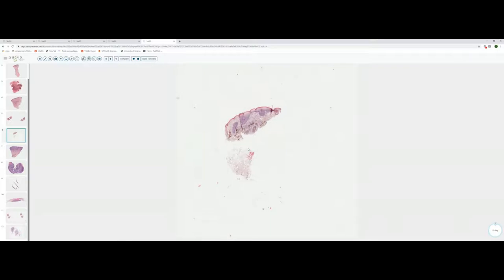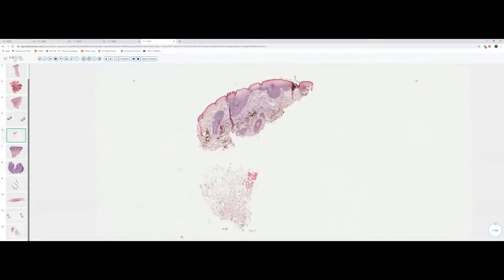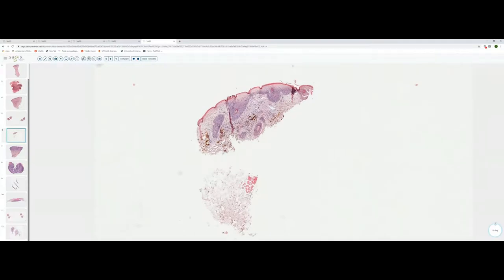Slide six is a much smaller biopsy specimen. This is a punch biopsy, and you know there's a fairly high concentration of follicular units here, they're kind of small and vellus. Another clue to location on the face here is the presence of skeletal muscle. And remember the muscles of mimetic expression on the face insert into the dermis. So it's one of the few areas, face and neck, the platysma, where you're actually going to see skeletal muscle extending into the dermis.